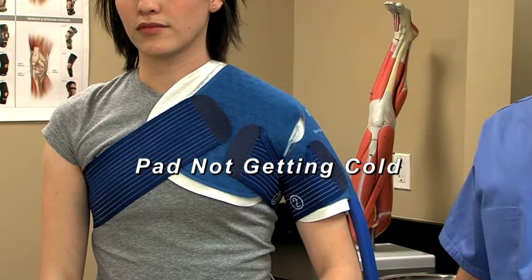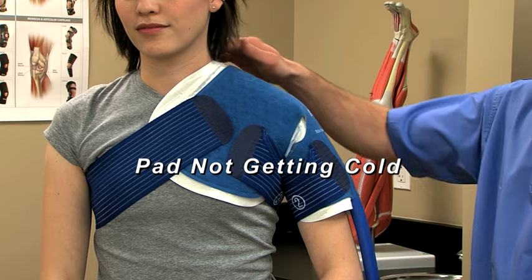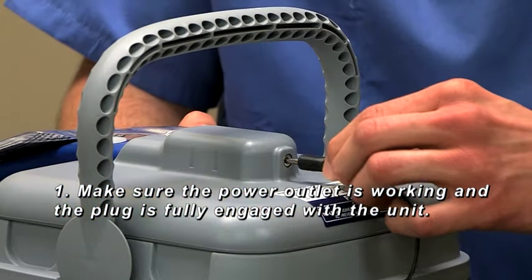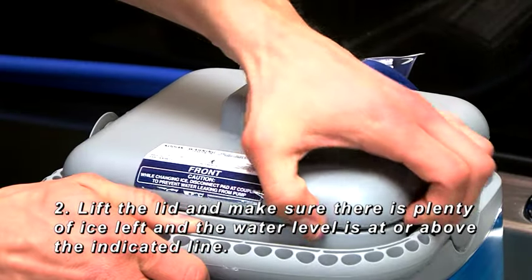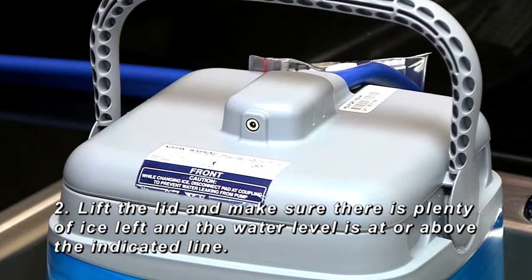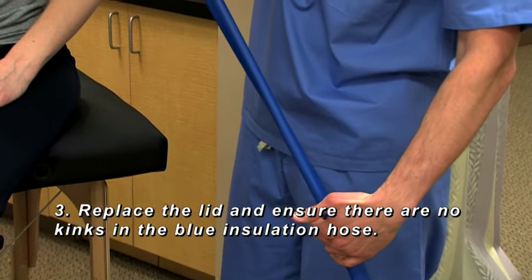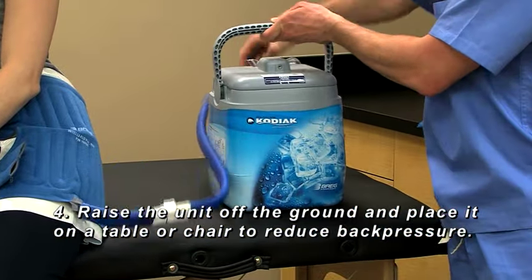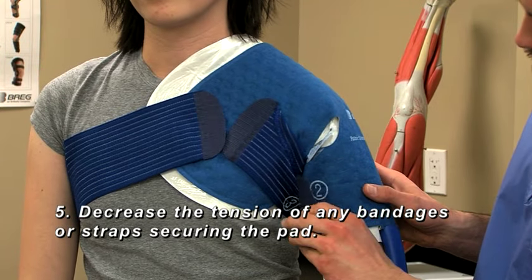If at any point the pad is not getting cold, take the following steps, one at a time, until the issue is resolved. One, make sure the power outlet is working and the plug is fully engaged with the unit. Two, lift the lid and make sure there's plenty of ice left and the water level is at or above the indicated line. Three, replace the lid and ensure there are no kinks in the blue insulation hose. Four, raise the unit off the ground and place it on a table or chair to reduce back pressure. Five, decrease the tension of any bandages or straps securing the pad.